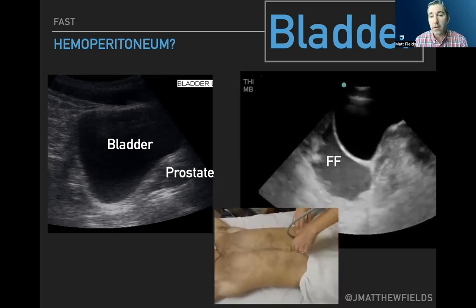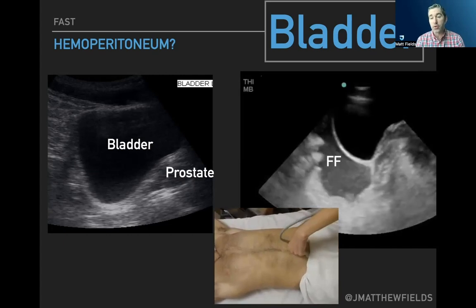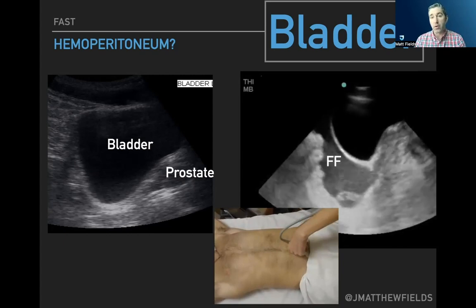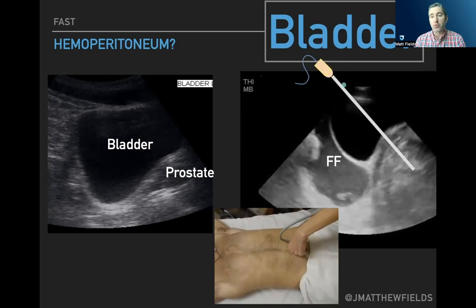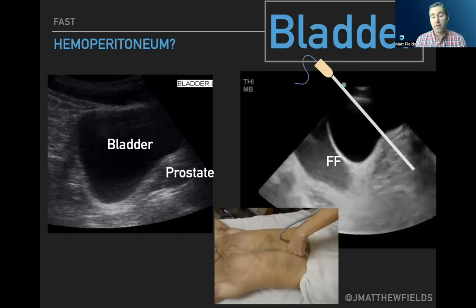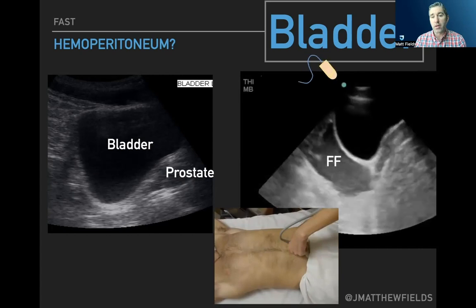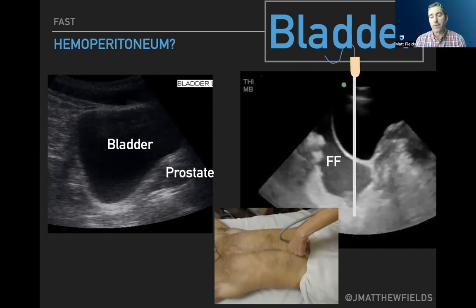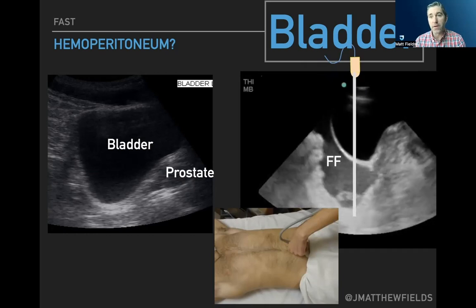One thing you got to be careful of whenever you do the transverse approach. So this is a sagittal image, but I'm going to show you what happens if you do a transverse approach and you take too steep of an angle: the beam of your ultrasound can go like this and totally miss the free fluid. So it's really important that you always try to slide down and go straight over, as low down as you can over the pelvic brim, to make sure you go through the free fluid. Alternatively, if you make sure you just do a sagittal view, you'll avoid this pitfall.